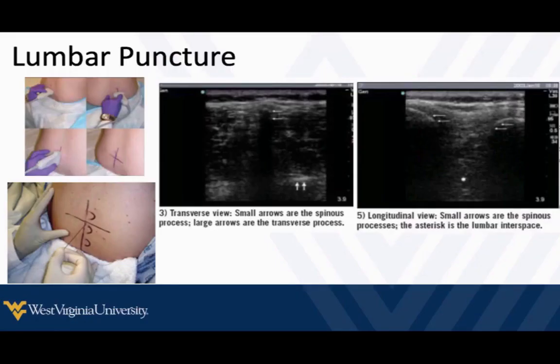This is a static technique. If the patient is a pediatric or very thin patient, we can probably use the linear probe. We need to get our transverse view of the spine first, but even before that, we want to get the patient positioned in the position we want for the lumbar puncture. We want them positioned, then mark them — we don't want them to move, because if we mark them and then they move, our marks are going to be off. So position them first, then bring out the probe.